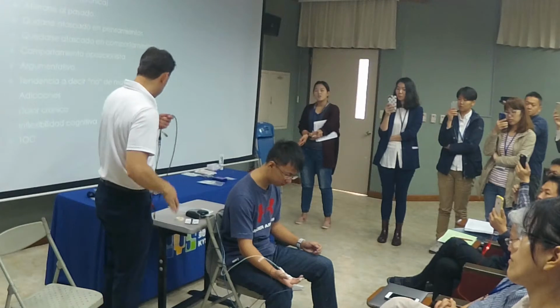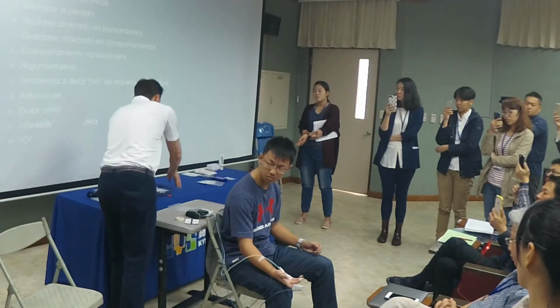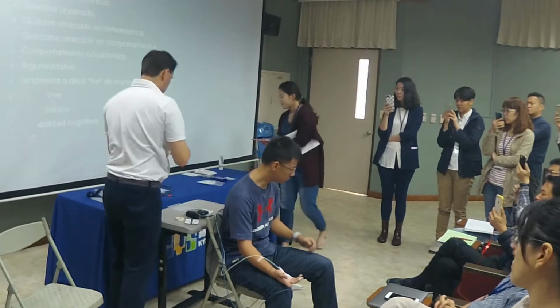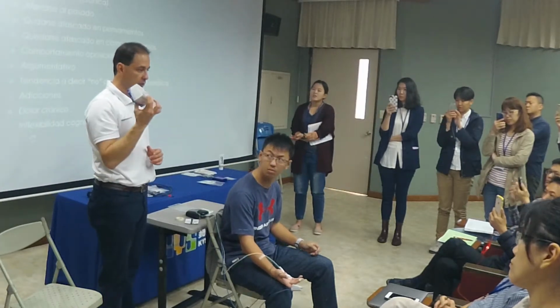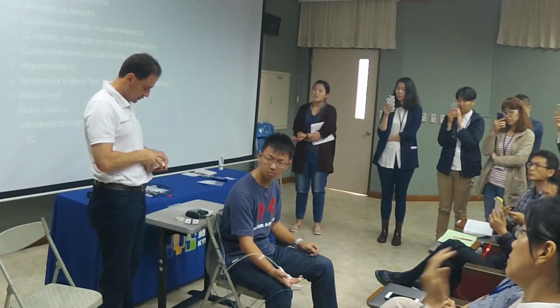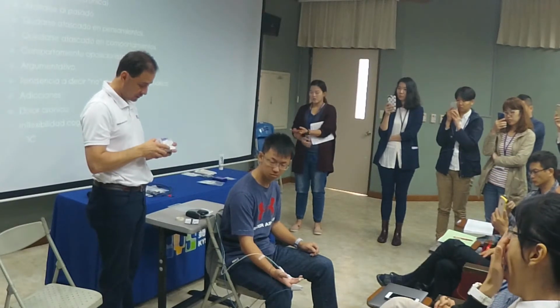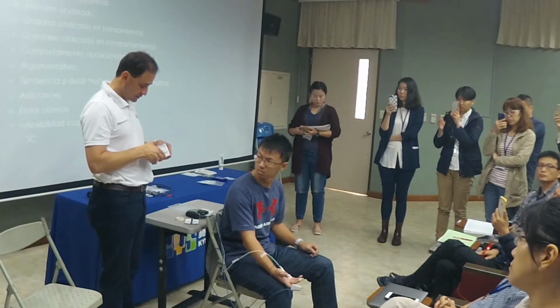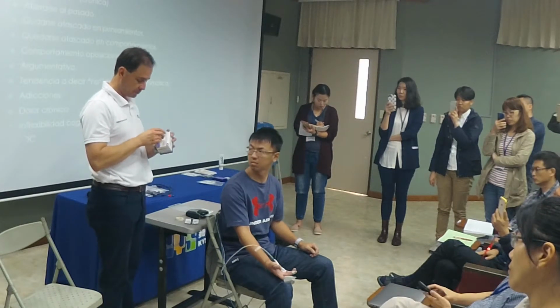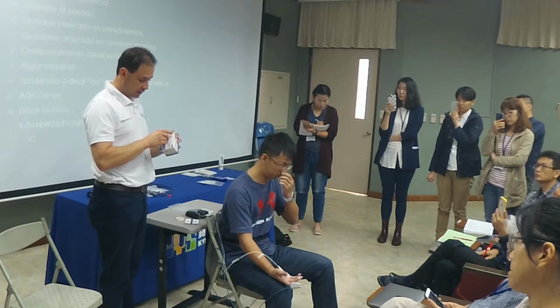Okay? So for that, I'm gonna use, can you hand me that, the box? Thank you. You can buy these alcohol swabs, which you use to abrade the skin on the scalp for neurofeedback, but you can use to abrade the skin for biofeedback. So what you're gonna do is abrade the skin.